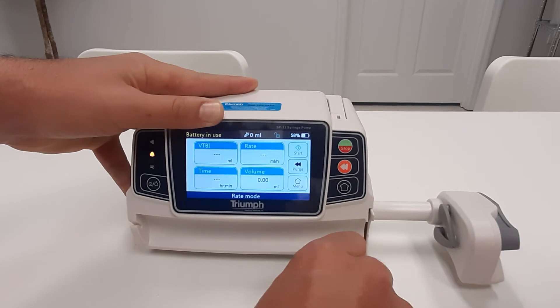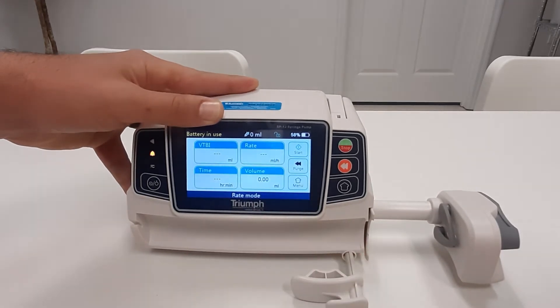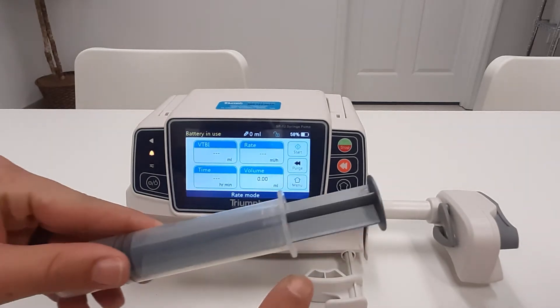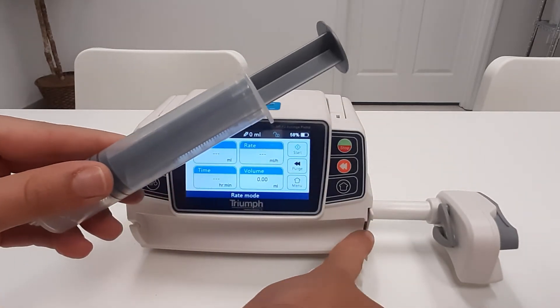Once turned left or right, the clamp will stay engaged. Install the syringe, ensuring the flange is seated fully in the flange holder.